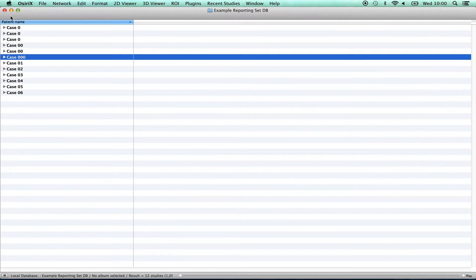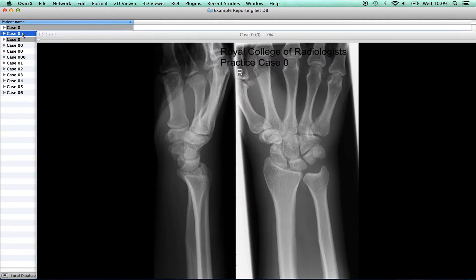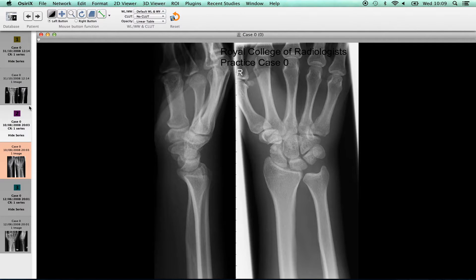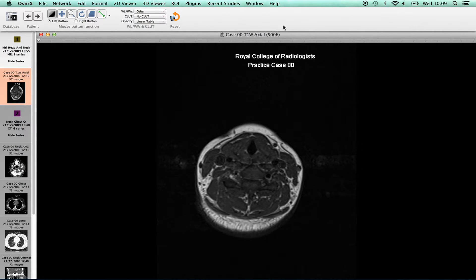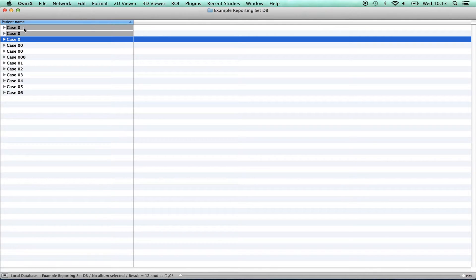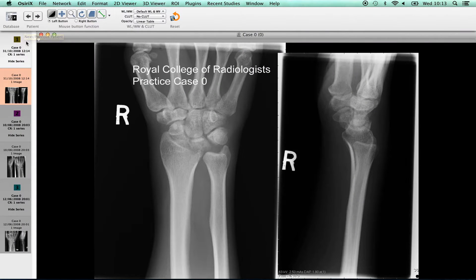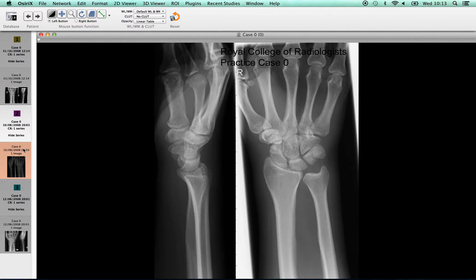The exam cases are labelled from Case 01 through to Case 06. All parts of each case are listed, so it can initially appear that there are three copies of Case 0. Clicking on any of the three lines for Case 0 will result in the automatic loading of all parts of the case. Examination cases are labelled with the relevant case number and a general description according to content. Practice Case 0 is made up of three images, which are listed as thumbnails down the side of the screen, and all thumbnails should be clicked in order that all the images that make up that case are viewed.